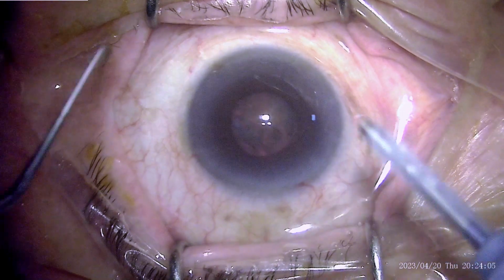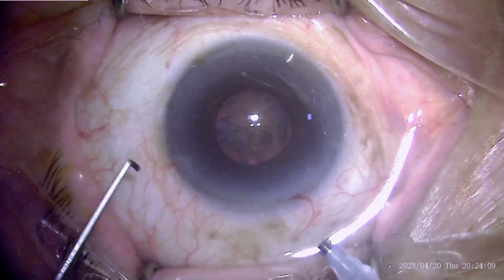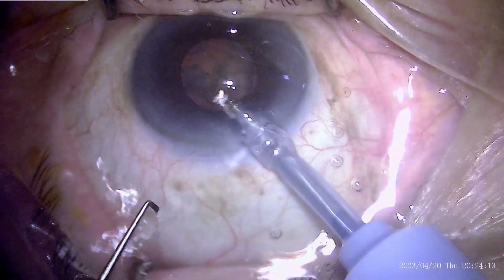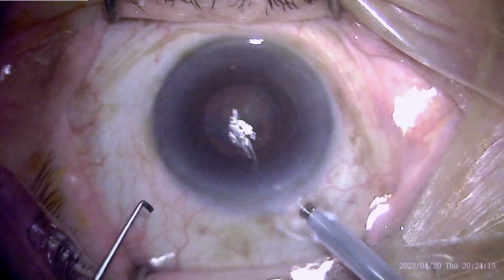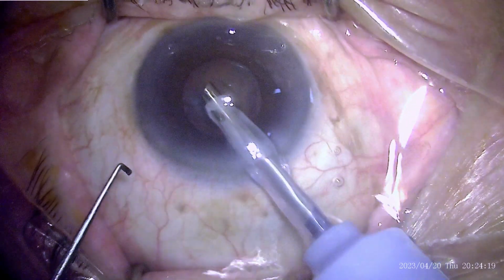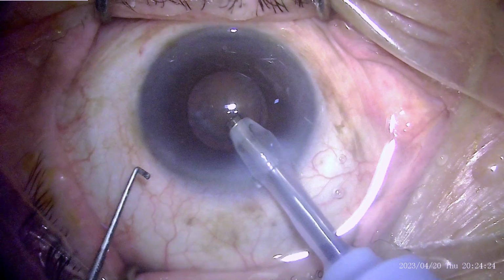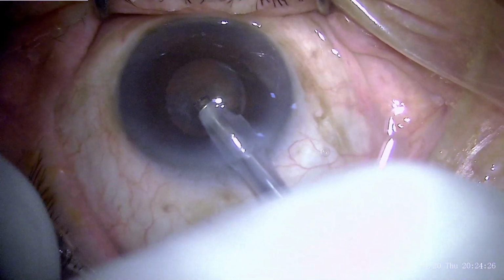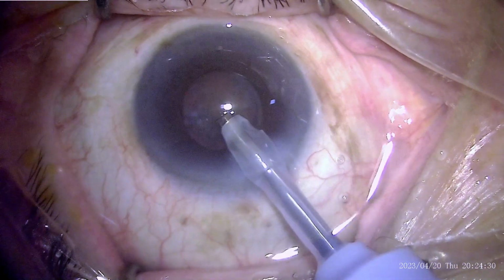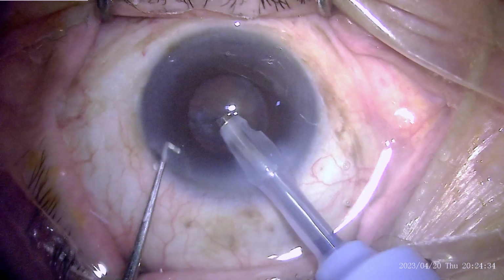However, we will proceed with the phacoemulsification. I must mention that the other eye also has been operated and had a similar problem. However, in that eye we had a softer nucleus, and it was operated about a year back. Now proceeding with the phacoemulsification, we can see the irrigation path is slightly turned towards the cornea, which is aligned back so that the flow of the fluid infusion line is not towards the corneal endothelium.